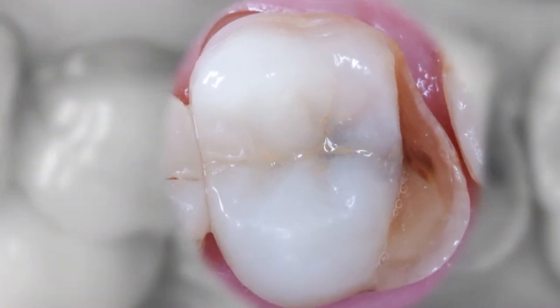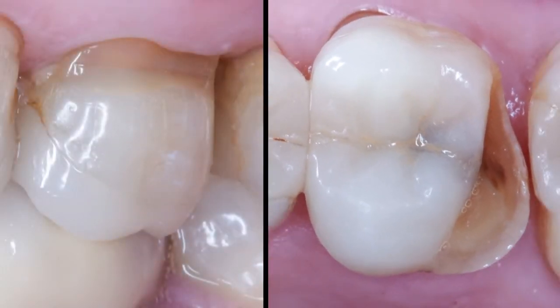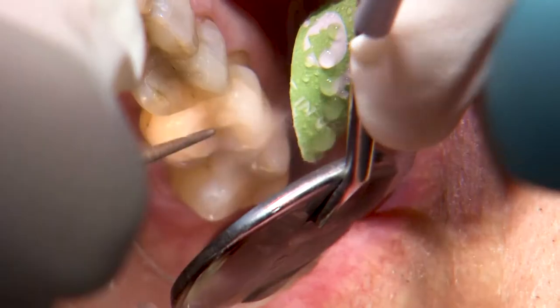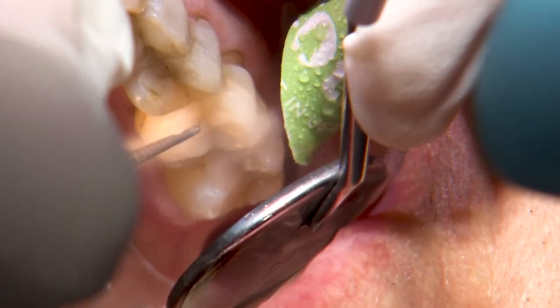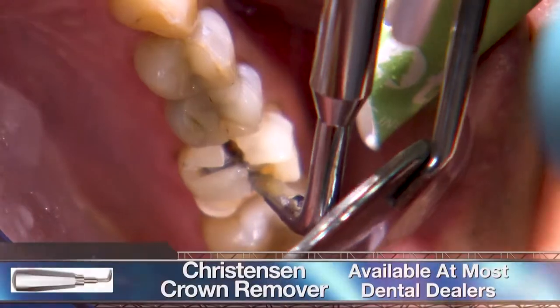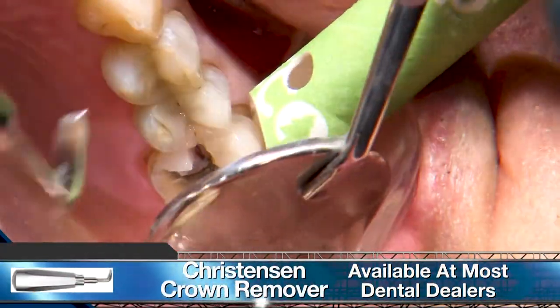My patient presented with a fractured all-ceramic restoration on his upper left first molar. With most all-ceramic restorations, we can pretty much assume they're bonded in adhesively, so often requiring multiple slots to reach the prep beneath. After the slots are created, I use a Christensen crown removal tool to then separate the sections off the tooth.